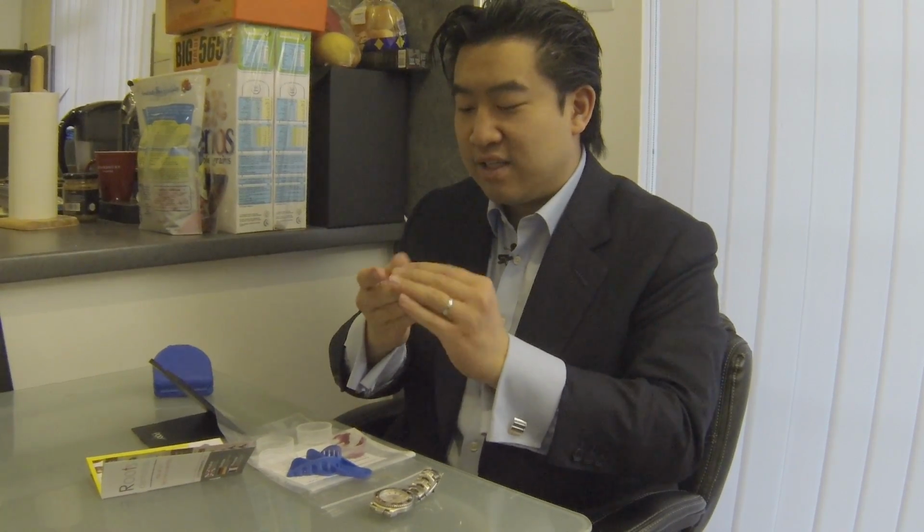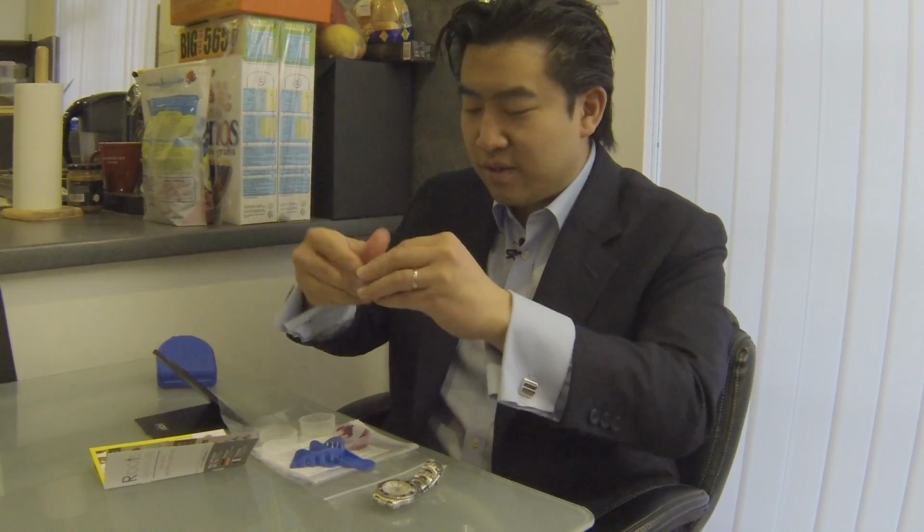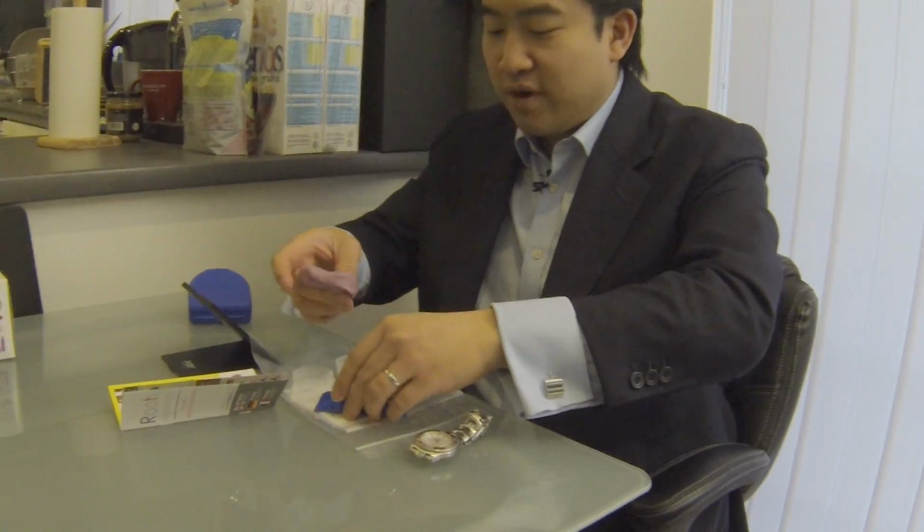Once I shove this in my gob, I'm going to actually be quiet for once. I'm not going to do any talking whatsoever as I try to align this thing in my gob, and I bite down, and you won't hear me talking for a few seconds because I'll fast forward it so that you don't have to hear me. It's actually warming up. It's like some sort of catalyst, or it's just taking the heat from my fingers.